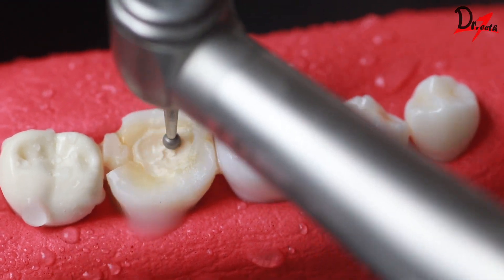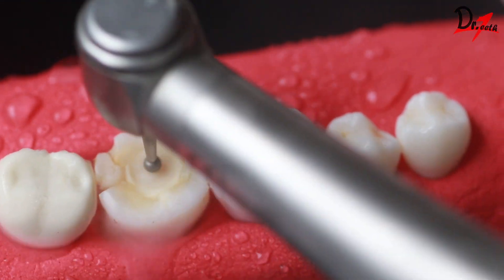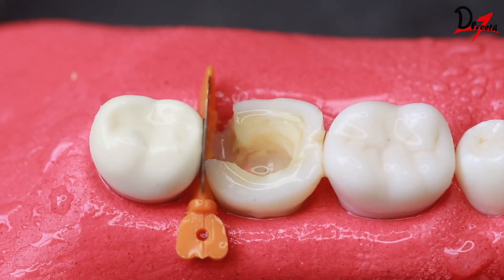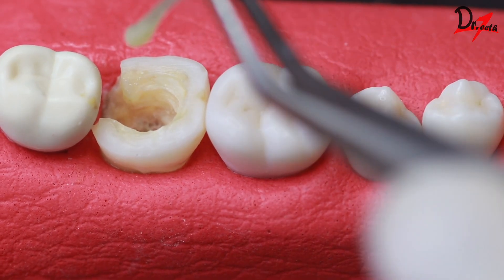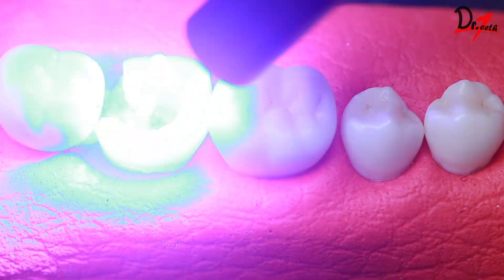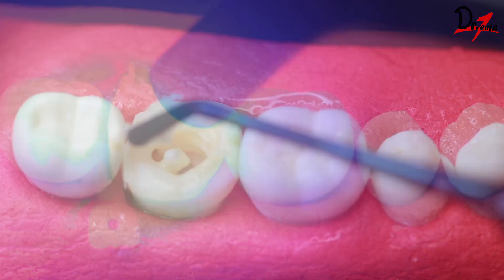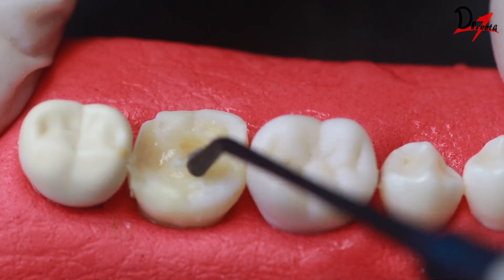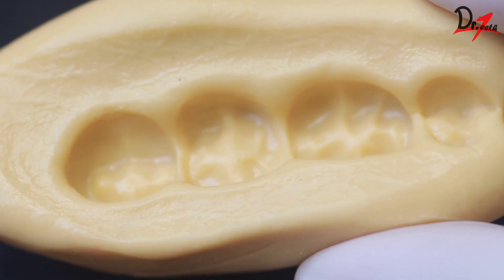Hello everyone, Assalamu Alaikum. A little backstory about this tooth: this is a root canal treated tooth and as you can see the restoration has failed. So we have removed the old restoration and we have done a post and core in this tooth. After the post and core, I dugged the tooth to create a gross anatomy because I'm going to make a putty index out of it, which will be used to give the temporary crown after the tooth preparation. So let's begin with the tooth preparation demonstration.